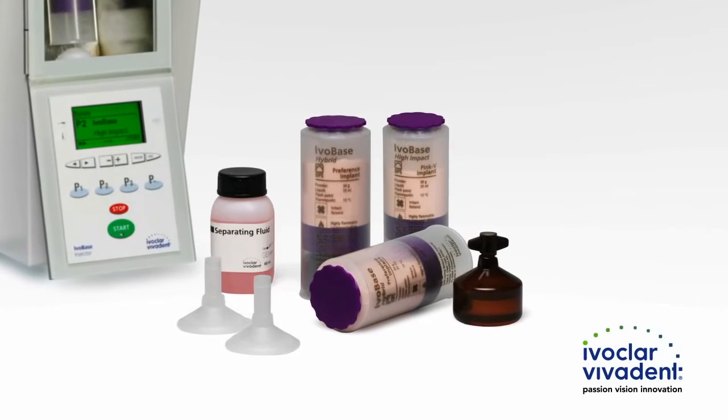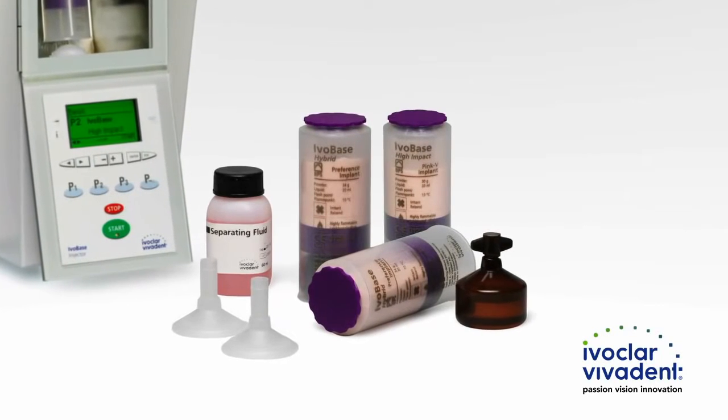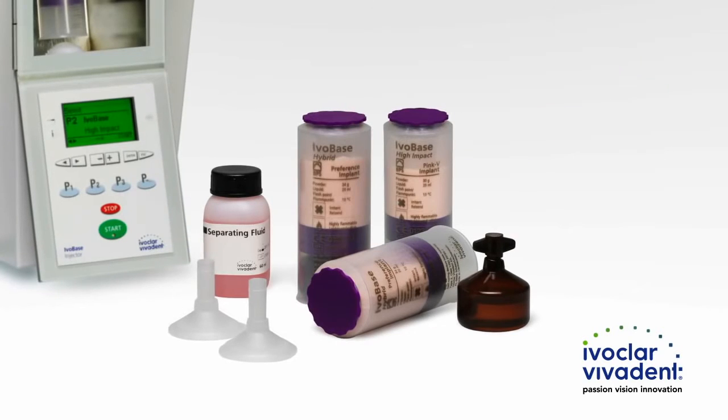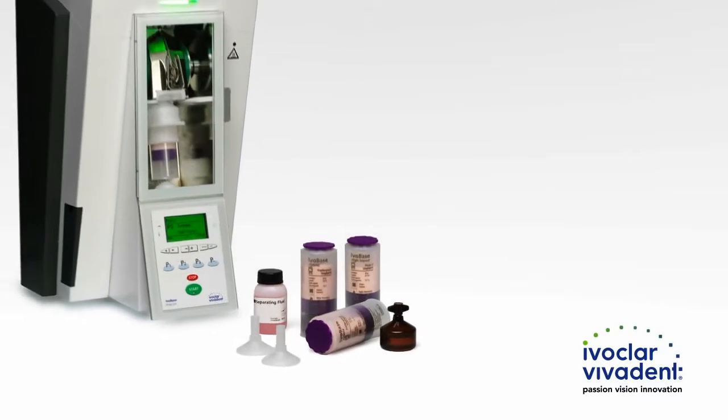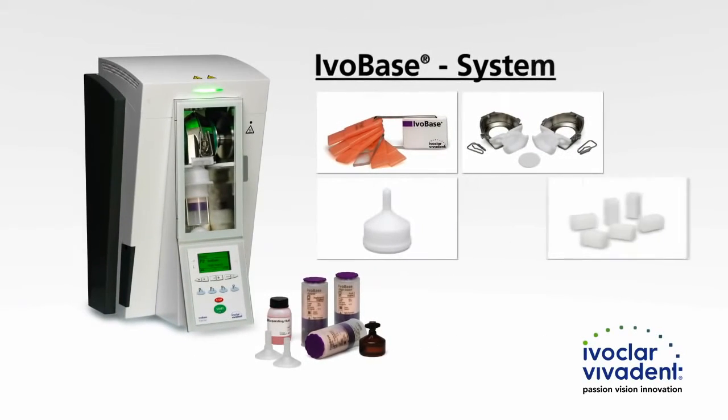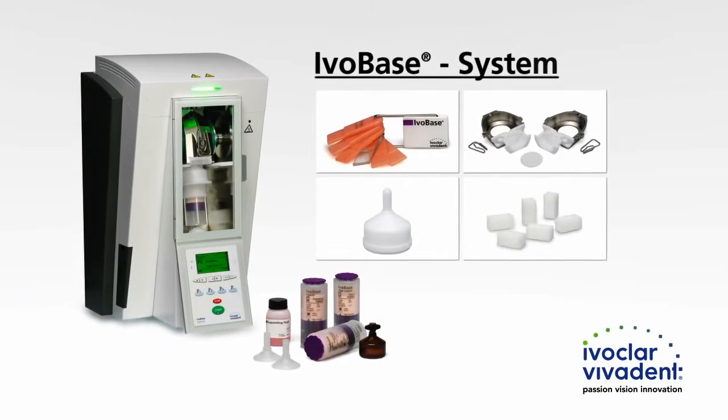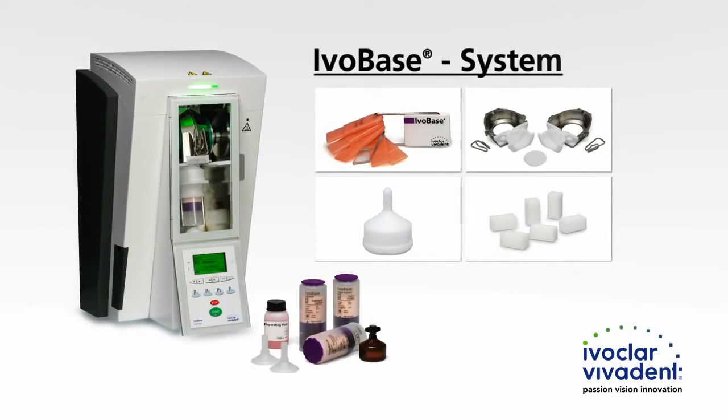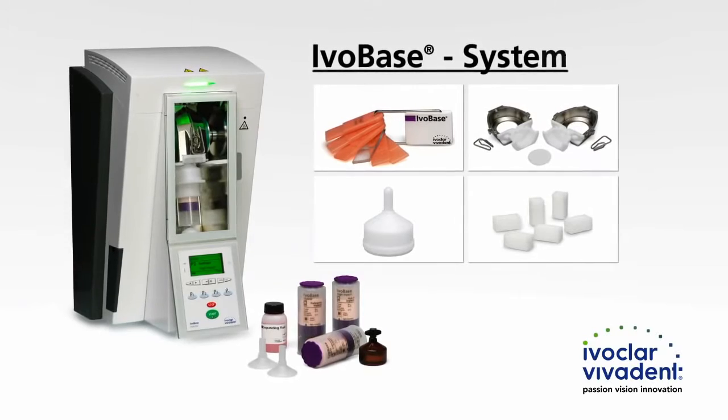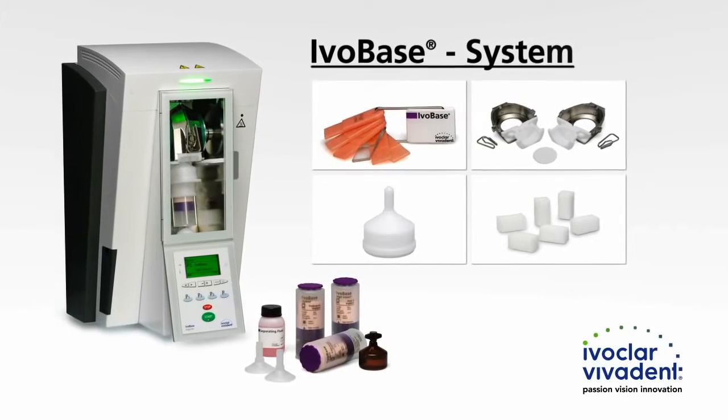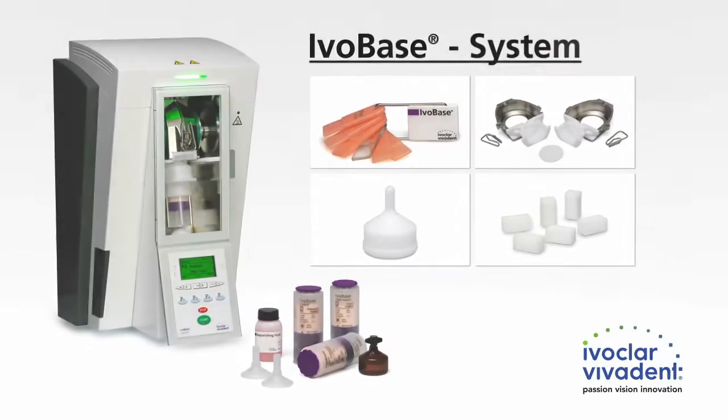The IvoBase material used is available in two versions, IvoBase Hybrid and IvoBase High Impact. This instructional video introduces you to the use of the individual system components and points out special features. Please refer to the instructions for use for more detailed information.